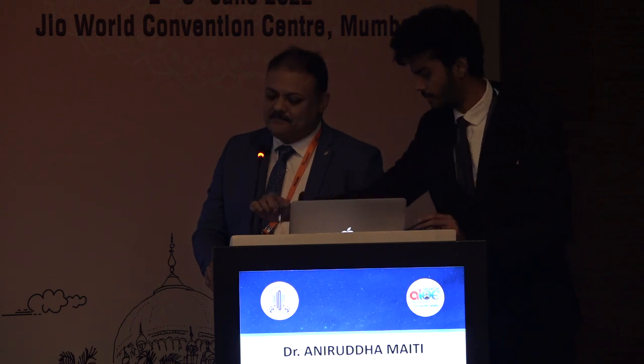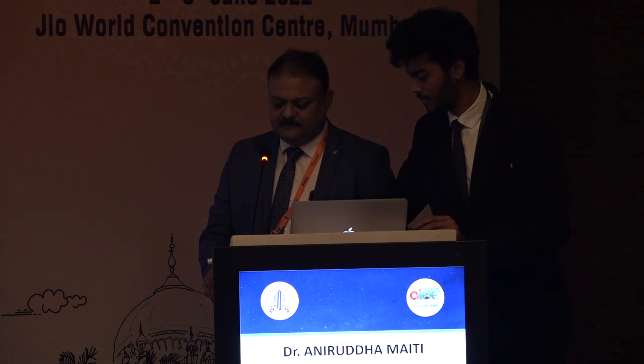So the take home should be, don't underestimate this type of case, because the ILM in this case is very vital. You have to preserve it. So do it under PFCL, keep it over the hole, and start doing fluid exchange, and then remove the PFCL, direct PFCL with air exchange, followed by gas injection.